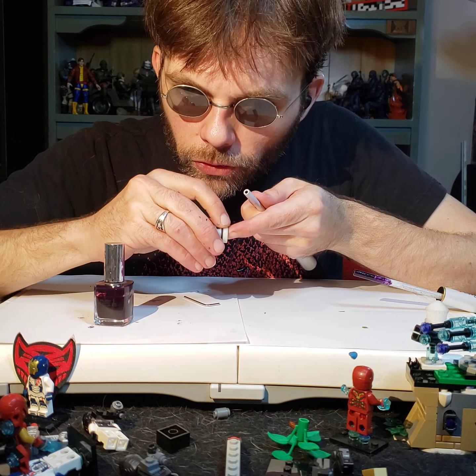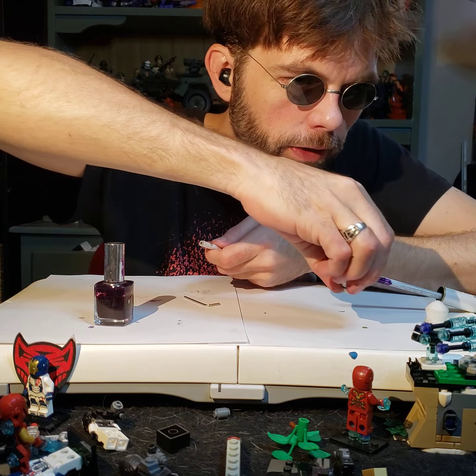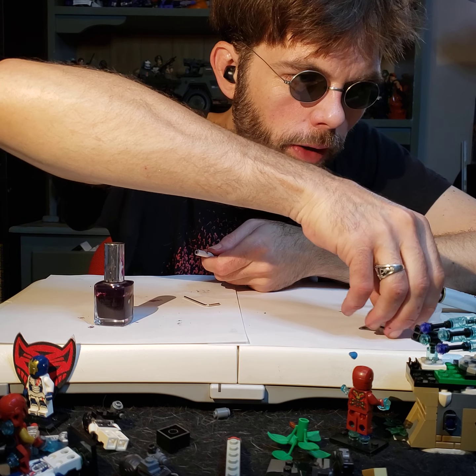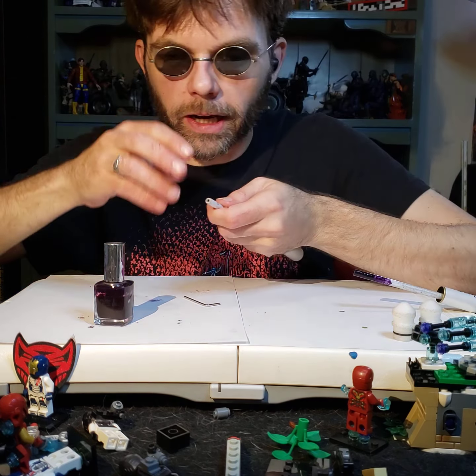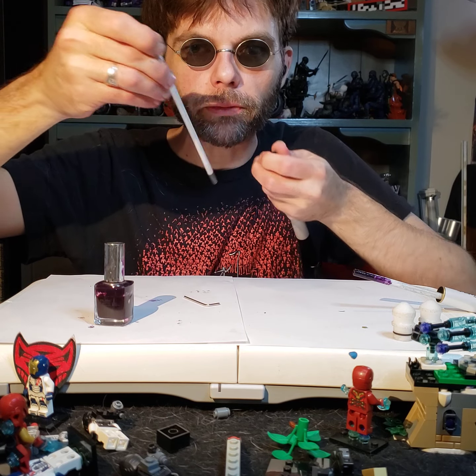So now we're going to find the end of that. All right. We're going to set it down over here. There we go. Right next to the other tip. I know, we got a couple of tips. Just the tips, though. Now we can pull this guy out.